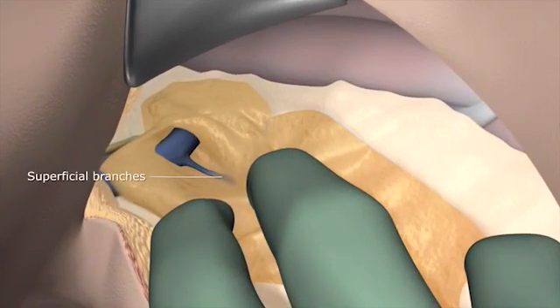Superficial branches of the vein may be visible. However, do not tie off these branches until the thoracodorsal bundle is identified.